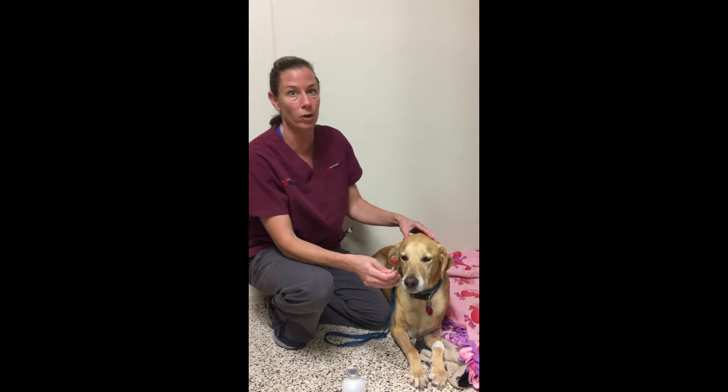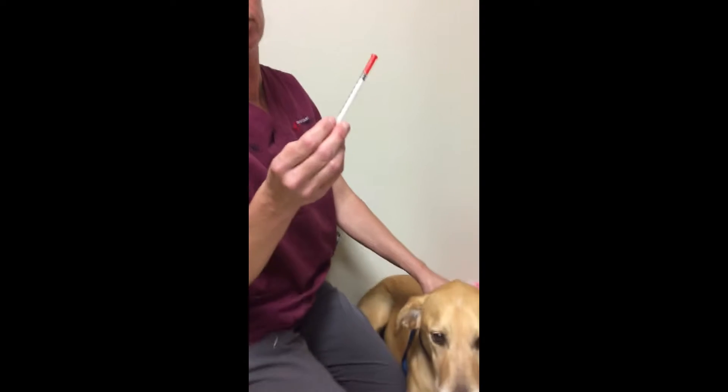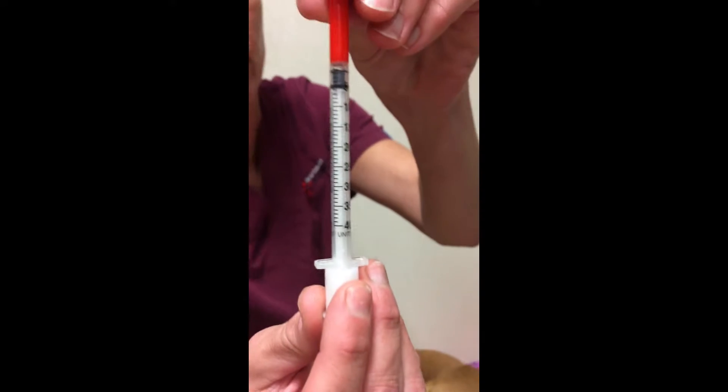The first thing that's important about your insulin injection is to make sure that you have the correct syringes that go with your particular insulin dose. Toby gets a 40-unit syringe.